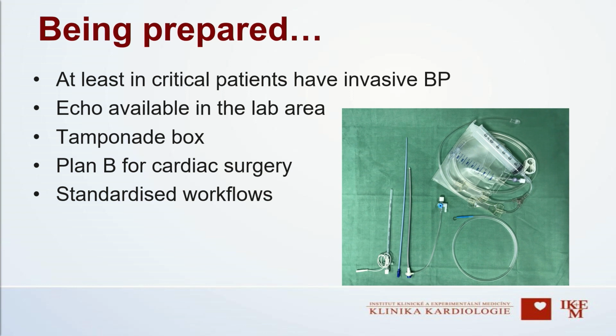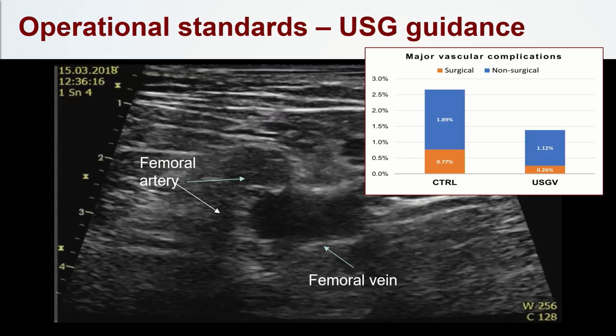You should be prepared, of course, because I worked in many centers, and if you ask, do you have a pericardial needle? They say, well, probably not. And you should have this set which you open only if you have tamponade, and nobody needs to run around the lab and look for a needle and look for some tubing, etc.